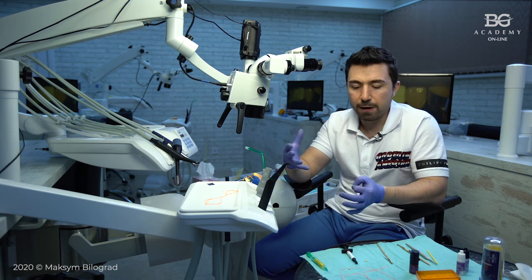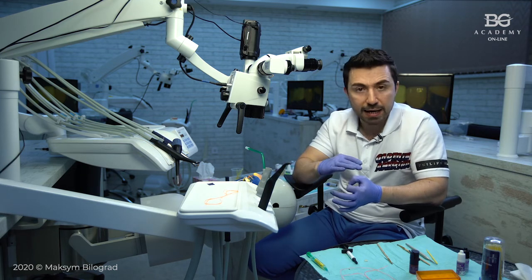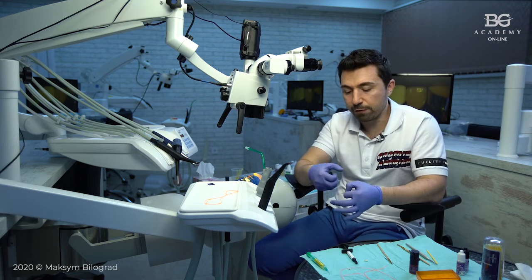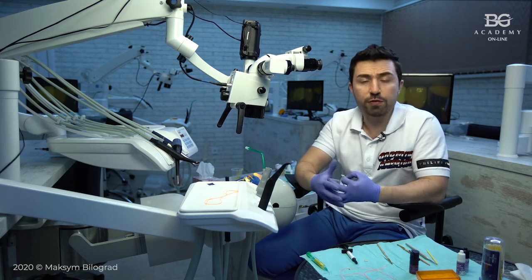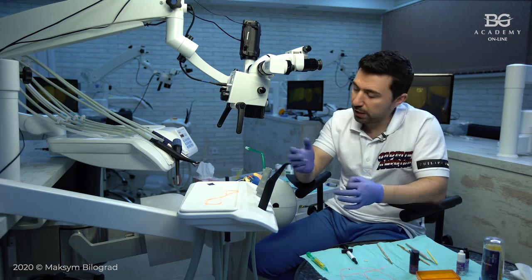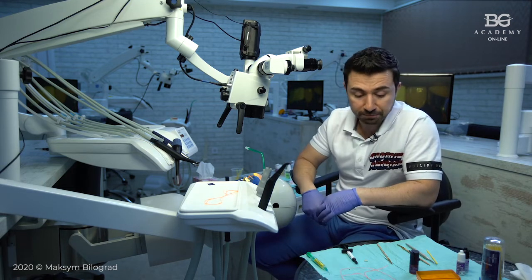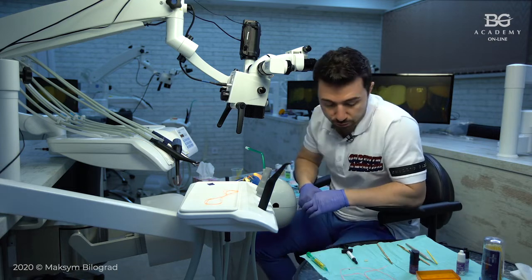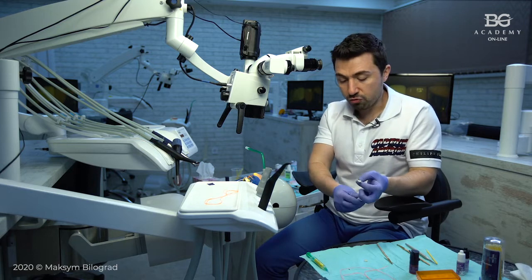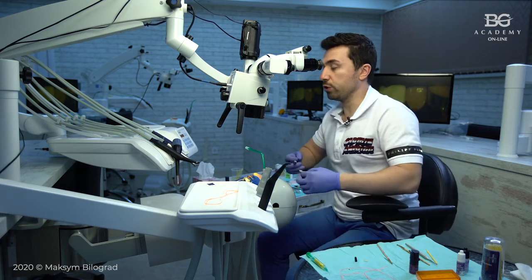So basically, the step of applying an adhesive layer on the ceramic surface is not mandatory. But if you put adhesive on the surface of your ceramic, you will get the surface more wet. That will be better for the cementation process. So we have our adhesive on the veneer, dried, thinned, and on the tooth.